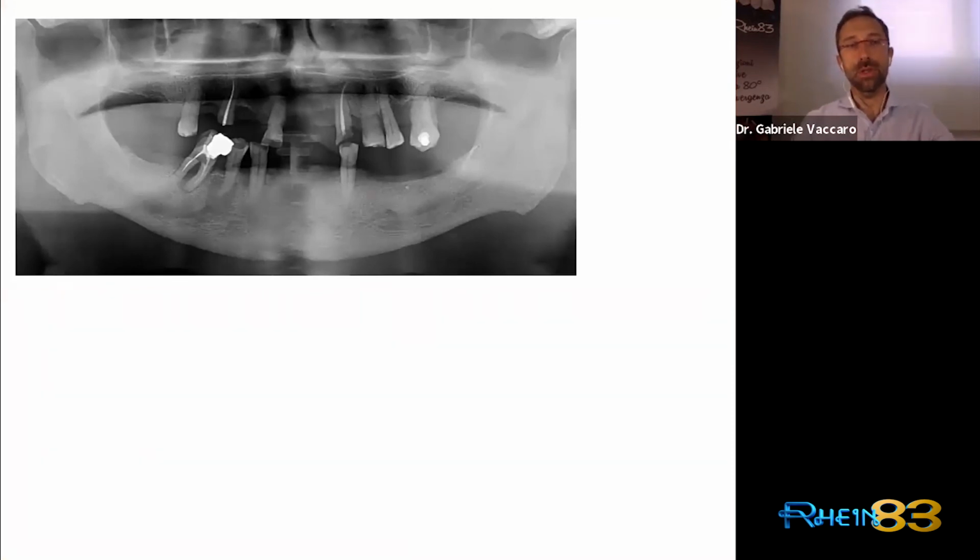Let's see another situation. Remember, in the first slide, when a tooth is hopeless, good, or questionable. Of course, we can make a partial denture, saving all these remaining teeth. But we have aesthetic problems, because we will have a lot of clamps showing during the smile. We also have a different material in the occlusal plane, because we have resin and enamel of natural tooth, so the wearing rate against the lower arch is not equal over time.